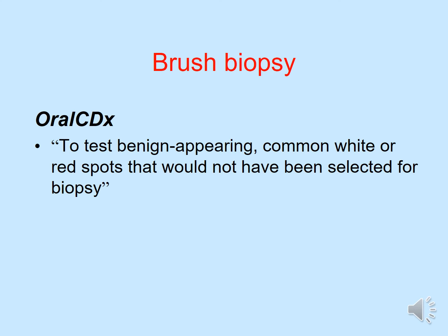Then they use technology to scan through the slides using advanced technology to be able to detect abnormal cells. I'll show you an example of the report. And because it is automated, there is a very high degree of sensitivity and specificity of this diagnosis.